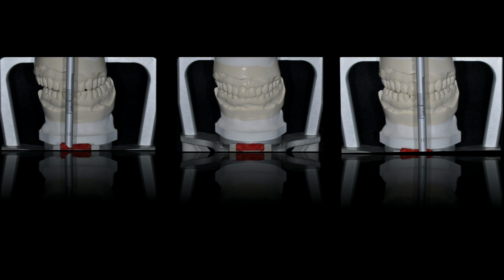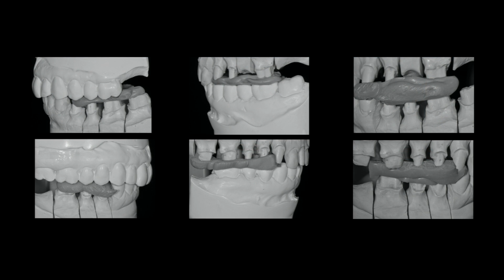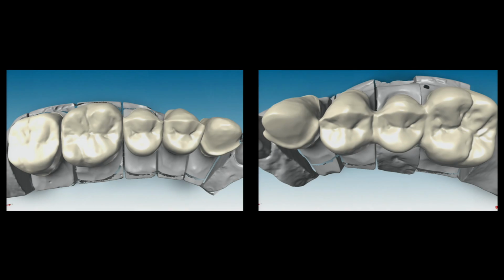And we also make impressions of the provisionals. We mount them on the cast, and they serve as a guide from an aesthetic and functional standpoint for the design of the definitive restorations. The casts are cross-mounted with the working cast, and now we design the framework on the computer.